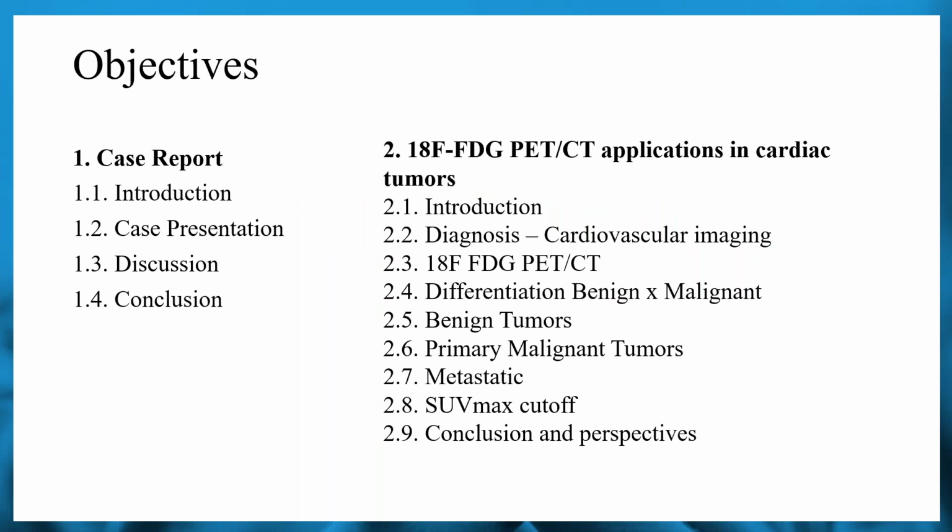These will be the topics that I'll go by during the presentation. I'll start with the case report, a brief presentation with a minor discussion regarding the case. And I'll go on with the revision article that was part of my scientific initiation program with Simone. I helped her write this revision article about the FDG PET CT applications in cardiac tumors, focusing on the differentiation between the benign and the malignant cardiac masses. So let's begin.